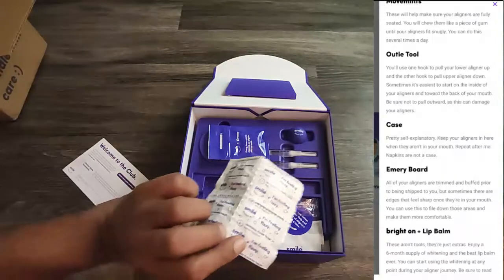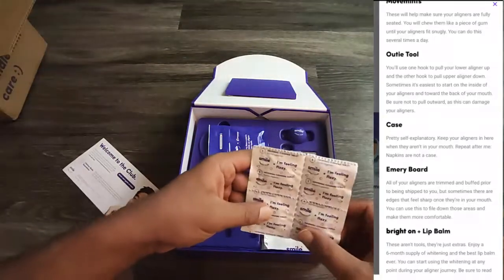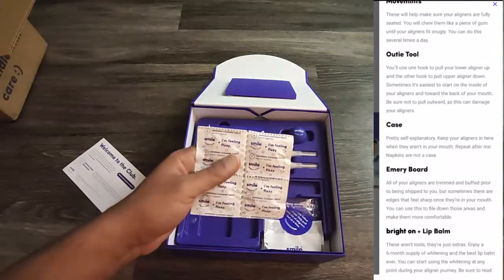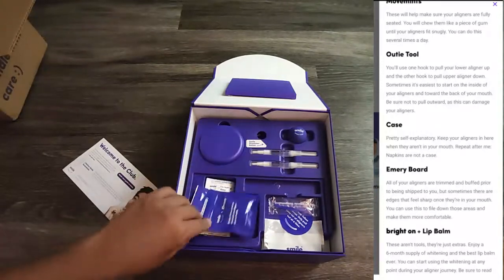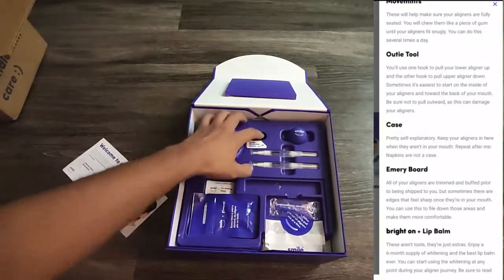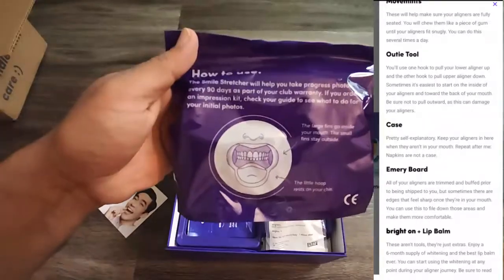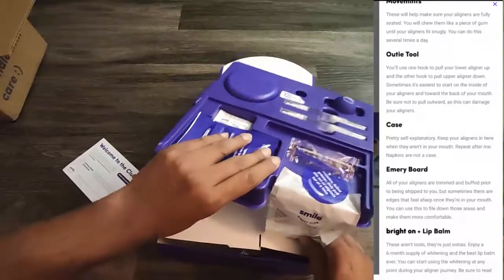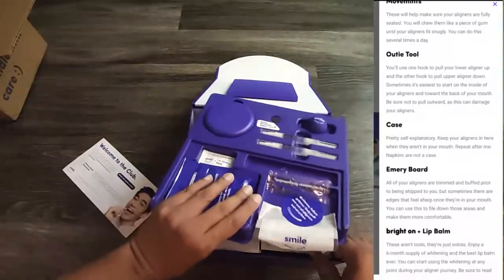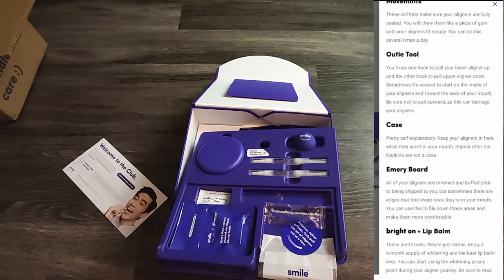For cleaning my aligners, I wash them in soapy water and that's enough. However, they've also included cleaning tablets which you can use to clean your aligners. In addition, there's a filing emery board to file the aligners if they're too tight — it fell inside the box so I couldn't show it clearly in this video.